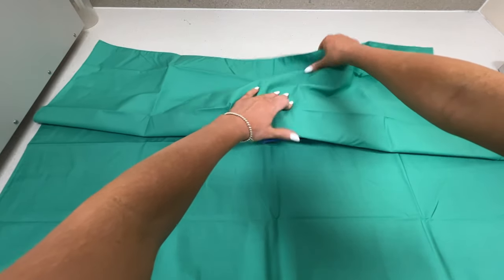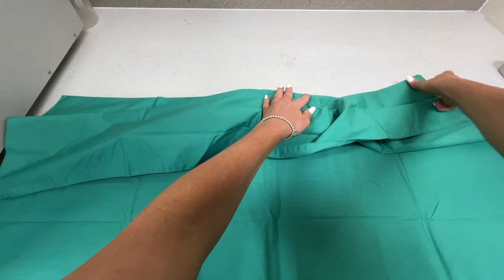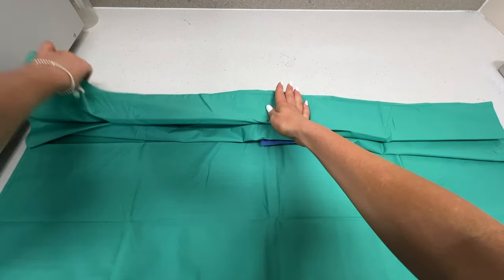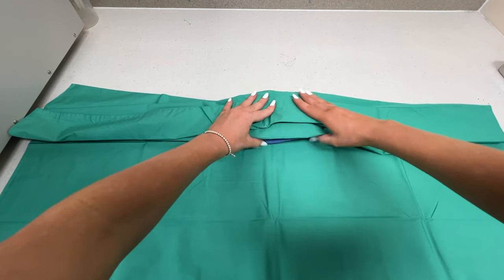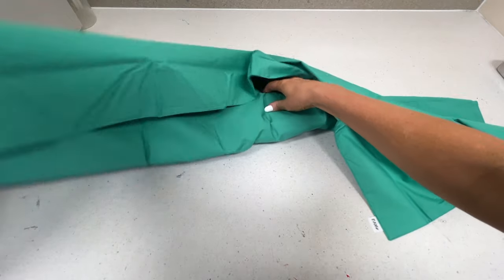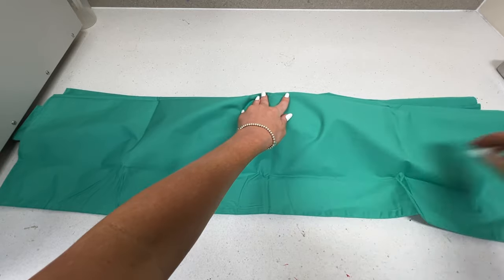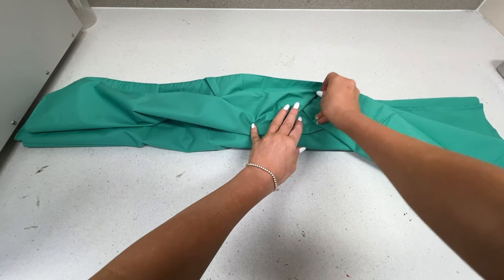Pull nice and tight and now I start my concertina coming towards me. Pull out the edges, make sure they're all lining up, and then back towards the wall. Once you have washed and sterilized the drapes a few times they will form an indentation which makes doing this concertina easier because you can follow the lines. Going back towards the wall again, making sure it's staying together nice and tightly. We want it to be nice and small and secure so we can fit it into the autoclave along with other kits and instruments.